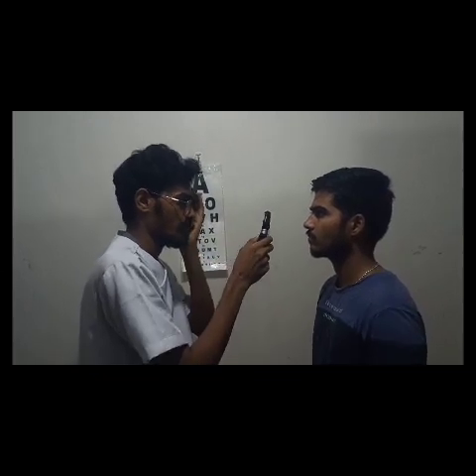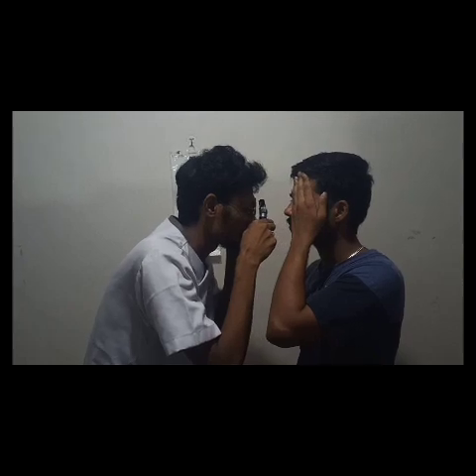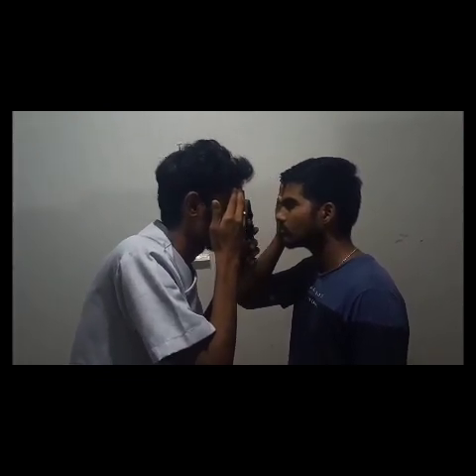Now we are moving on to the ophthalmoscopic examination. First place the diopter at 0. Check if the light is on. And use your right eye to check the patient's right eye. Can you close one of your eyes? Okay, next. Other eye. Okay, I can see your retina, optic disc, fovea, and macula.